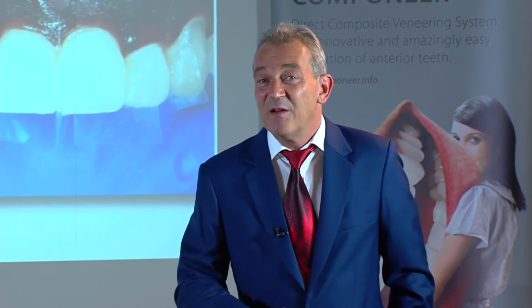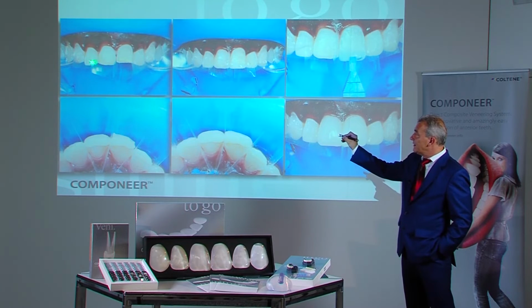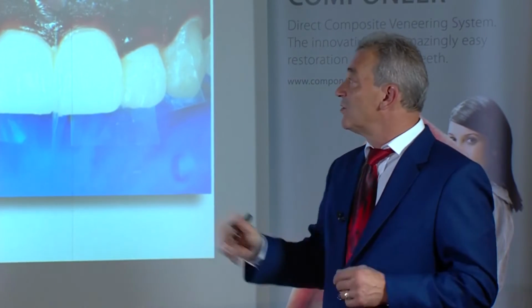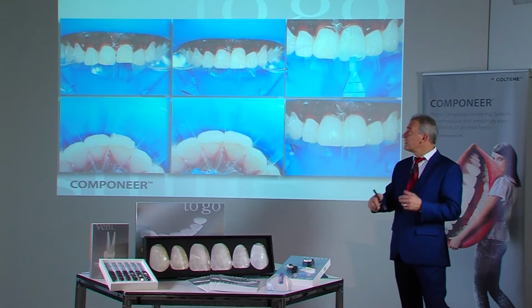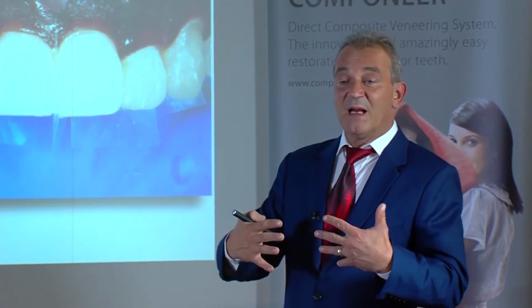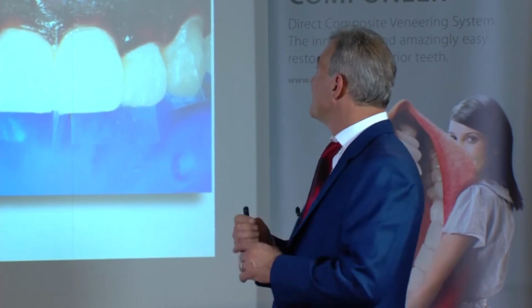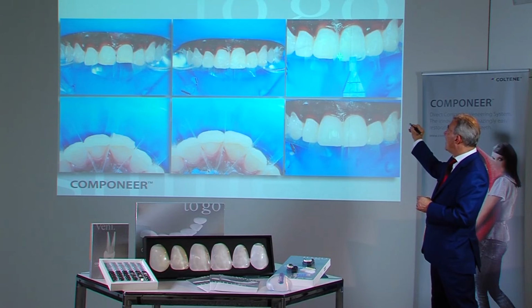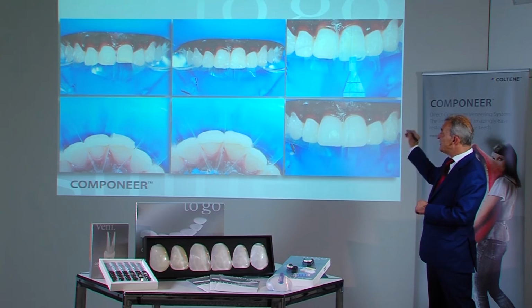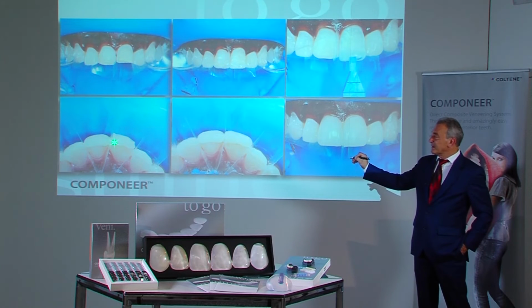And then we said, okay, but we have the wrong contrast line. This contrast line needs to be completed. So one takes some dentine mass and works up the contrast line. Basically, this can be done palatal by hand in small portions. This way one obtains a homogeneous subsurface under the componeer, which represents the last layer. In terms of selecting sizes, we can see that the length of a medium componeer is adequate. Then the componeer was placed.